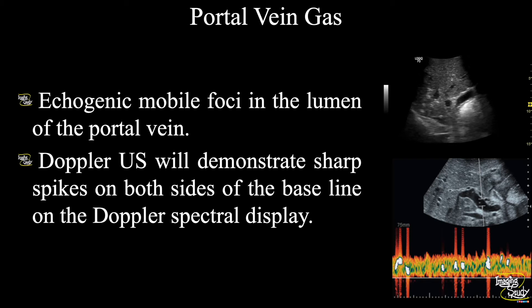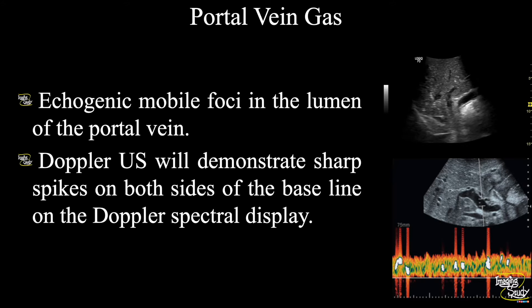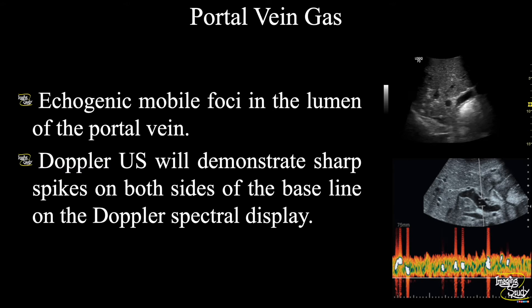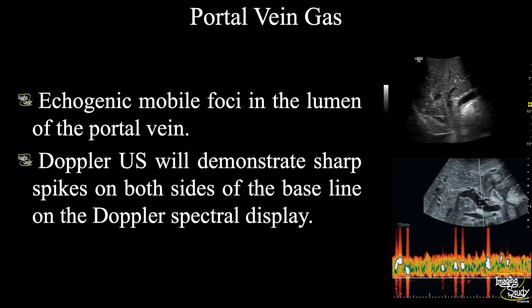Doppler ultrasound is very helpful in this case. On pulsed Doppler with a reverse rainbow color map, you'll see sharp spikes on both sides of the baseline. On regular pulsed Doppler, you'll see these spikes on the side of the direction of blood flow.